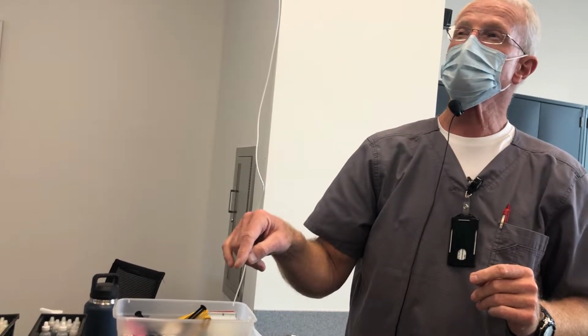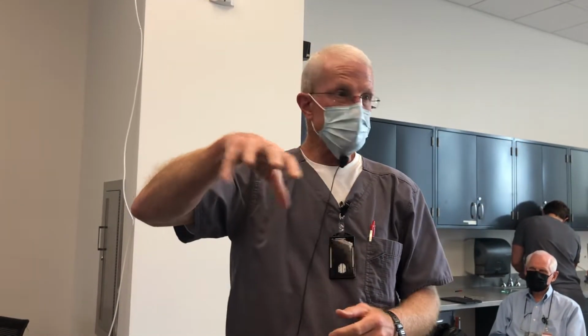So that's Tylock, and you will use Tylock from time to time. Tylock is used for cast post and core temporaries. It's also occasionally used for ceramic onlay temporaries. We're going to do those spring semester, but ceramic onlays rely on bonding. They don't rely on resistance and retention form. In fact, we over taper them intentionally, in the realm of 15 to 20 degree taper rather than 6 to 10. So your temporaries don't stay on very well.